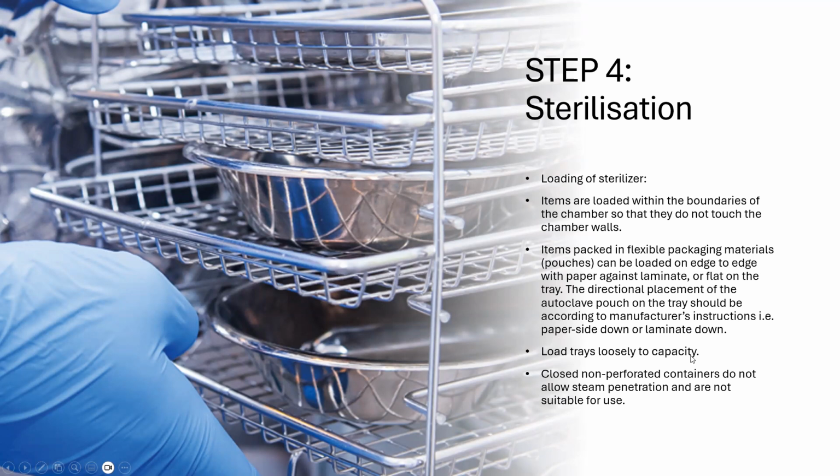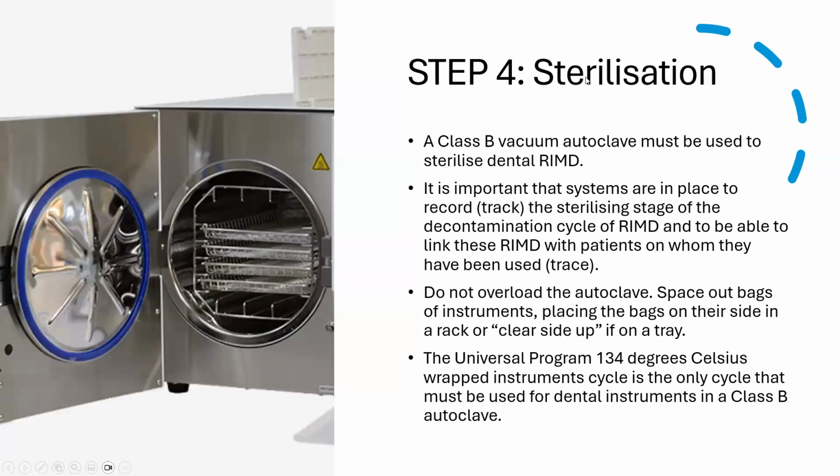Load trays loosely to capacity. Closed non-perforated containers do not allow steam penetration and are not suitable for use. They should not be used. Step 4, sterilization. A Class B vacuum autoclave must be used to sterilize dental RIMD.